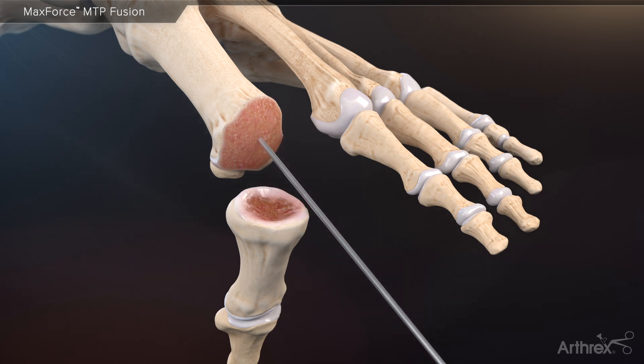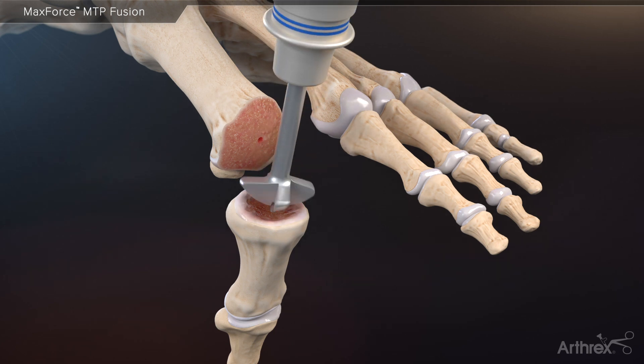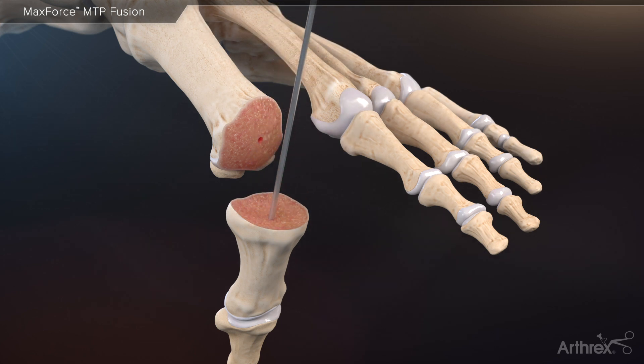While not depicted here, it is also important to create bleeding bone channels at the metatarsal and proximal phalanx by fenestrating the joint surfaces using a 1.6 millimeter K-wire. Furthermore, autograft calcaneal bone may be inserted into the joint prior to setting the position of the toe.